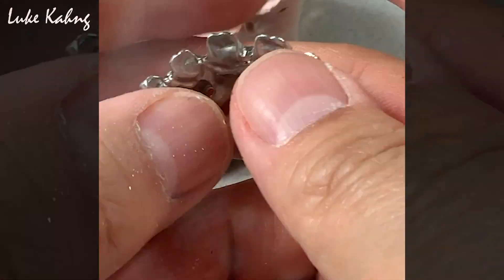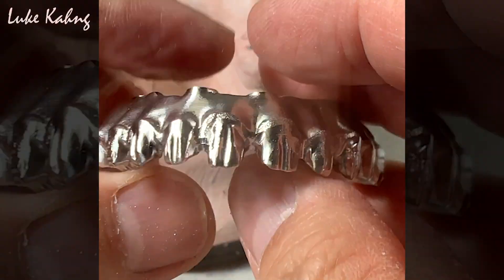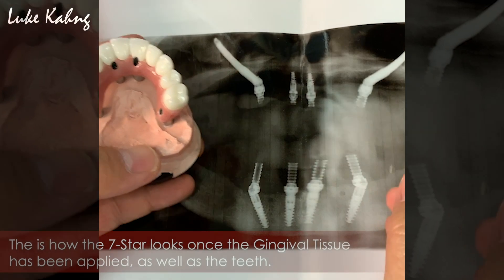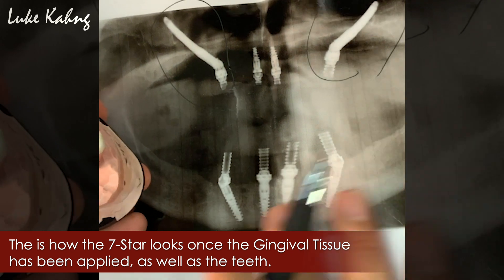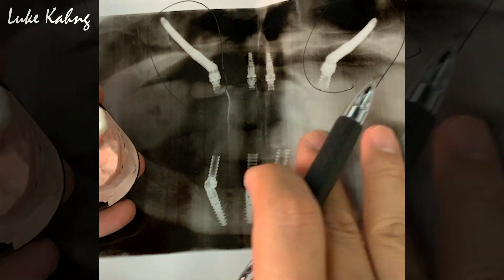Now we'll make the two-piece — coming up. This is a great inner picture with their implantologist. Beautiful job — top and bottom, eight implants.